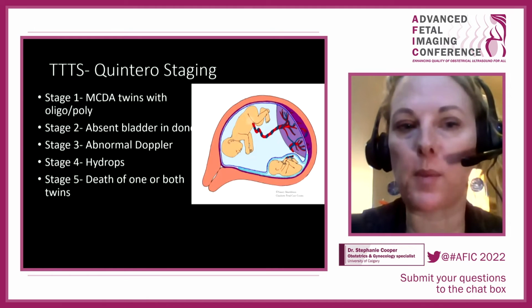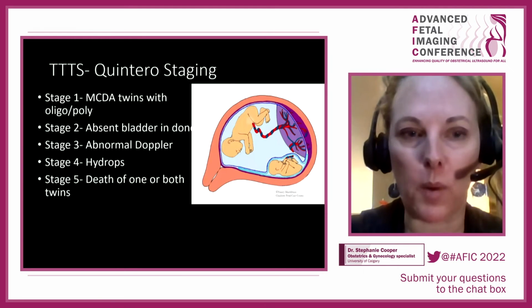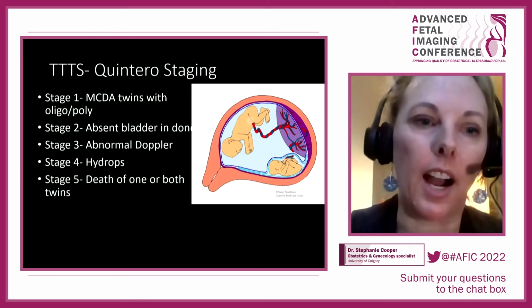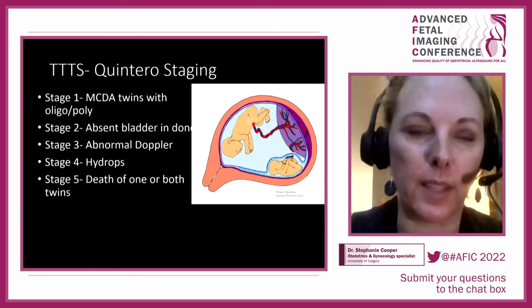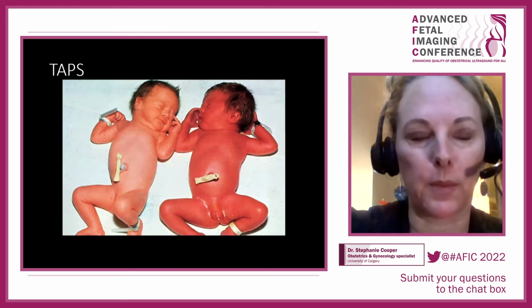So again, it's important that you can tell us, the obstetricians or the MFMs, what type of twins these are, and be able to recognize the complications that go with monochorionic twins, because they do need to be monitored by a high-risk pregnancy center. Our goal with rural telemedicine is that we can have a balance between having monochorionic twins have scans closer to home, and as well in combination with urban MFM sites. But there definitely has to be someone overseeing all of this.